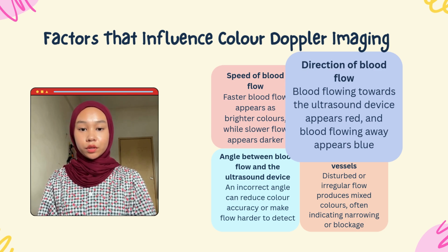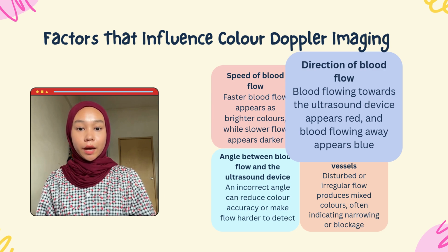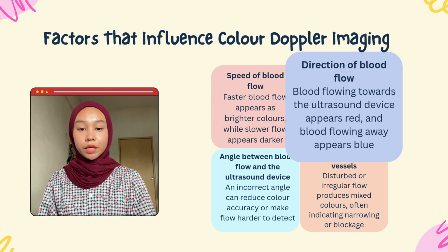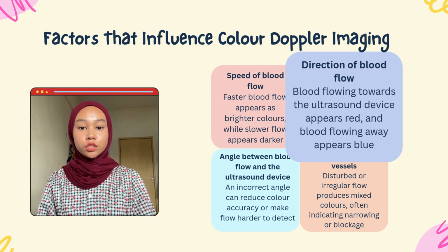If the blood flows towards the ultrasound device, it will appear red. But if the blood flows away from the ultrasound device, it will appear blue. If the direction changes, the color also changes.